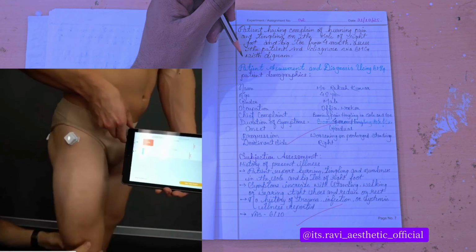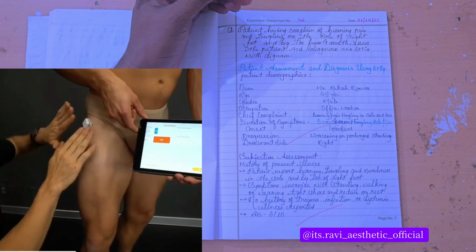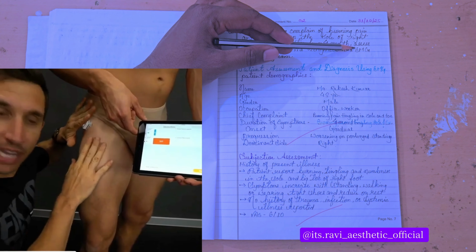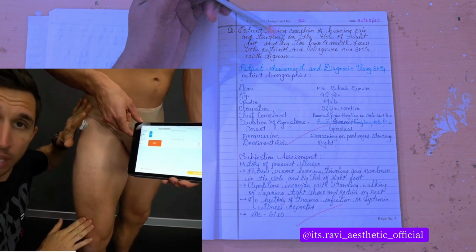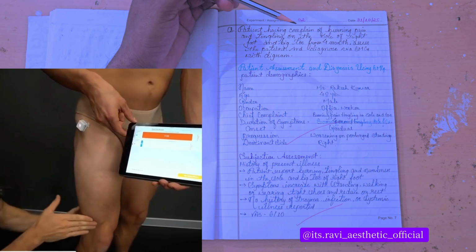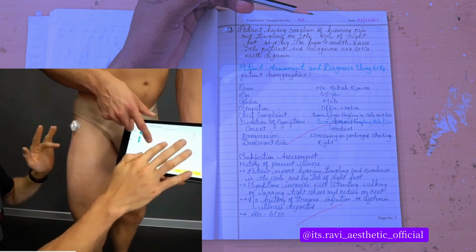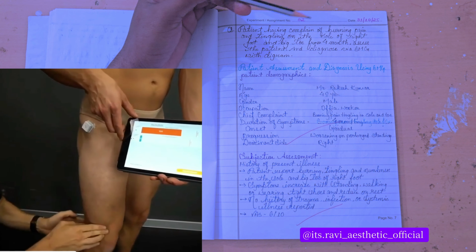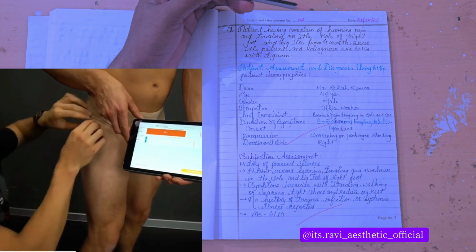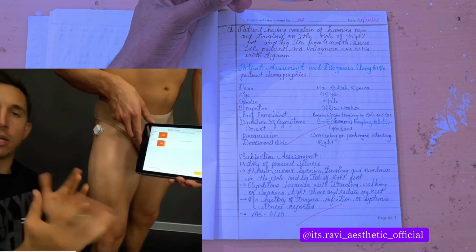So first, what I can write in this answer is assessment and diagnosis using EMG. As I can see here, EMG is written. EMG means electromyography. What is the meaning of electromyography? Electrical signal. Myo means skeletal muscle, and it is a graphical representation of the signals, neurologically stimulating impulses passing from the skeletal muscle, on the screen of the EMG.